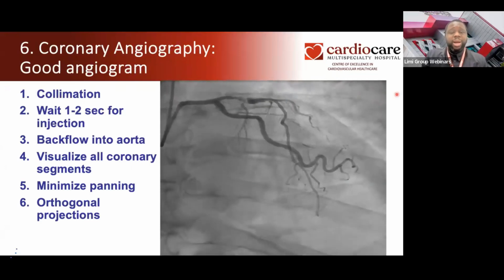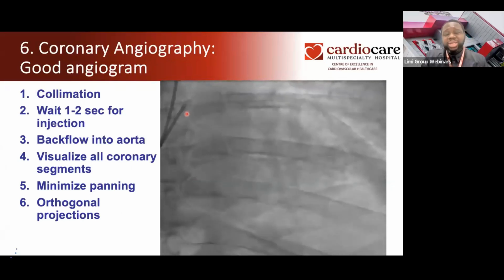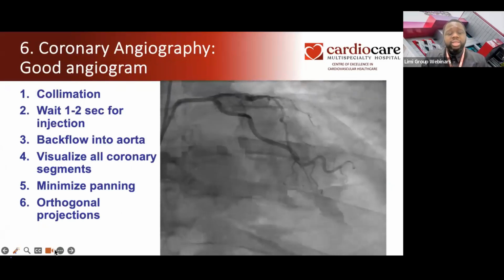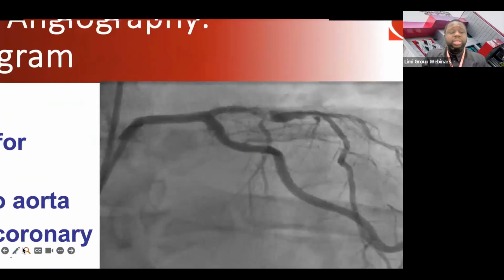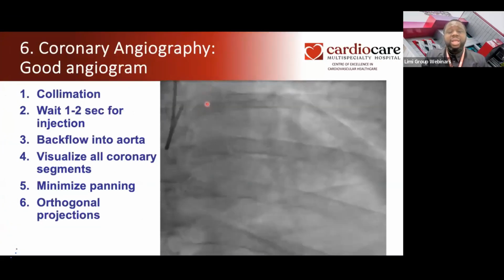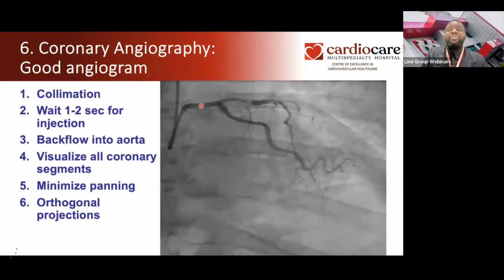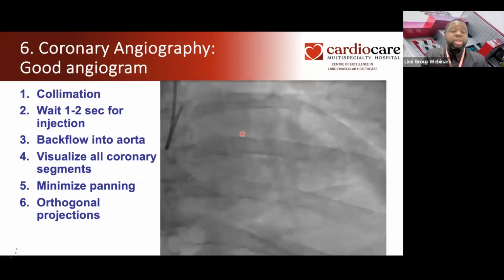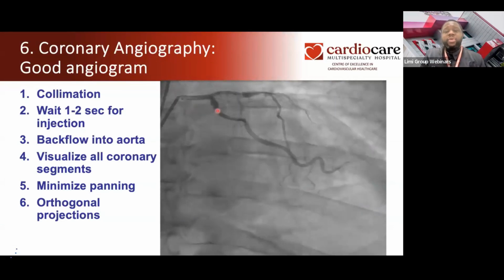Typically, you also check that there's backflow. If you give an angiogram and there's no backflow, it means that your catheter has completely occluded the origin of that vessel. I hope we can see that. If we give and there's no backflow, it means this catheter has entered completely and occluded, and it means the entire heart is not getting any blood flow from the contrast that you are pushing in. That is deadly.